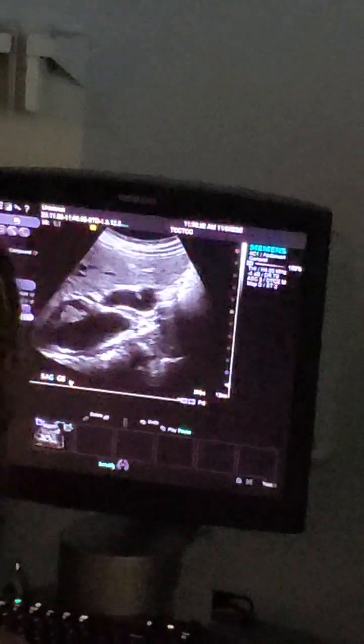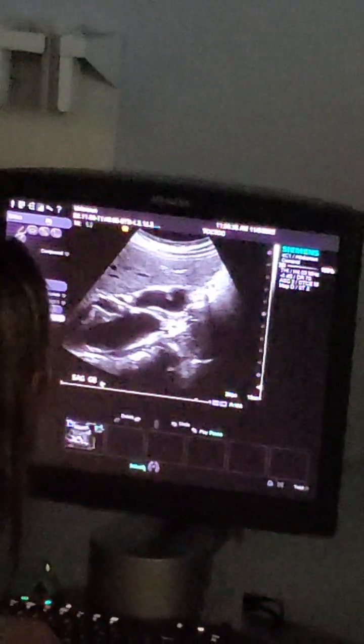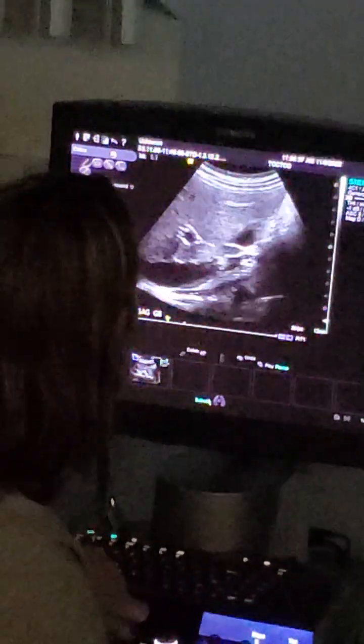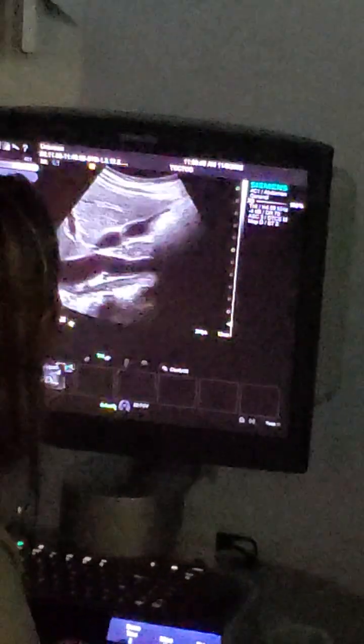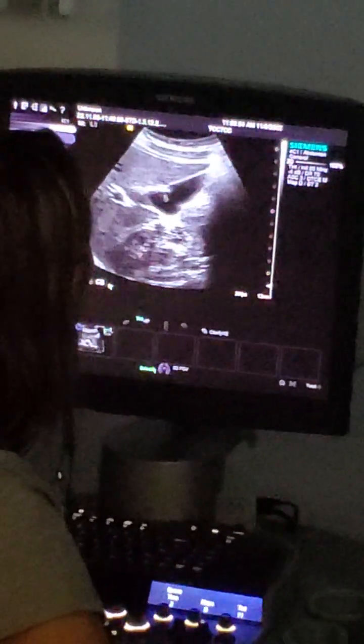And hers, in this case, where I have the liver window, I can go ahead and breathe. I can get fundus to body really well, or I can get kind of neck to body. So you might have to give me a couple of images if you don't see it very well. She's got a little kink under that ear. So now we're seeing.